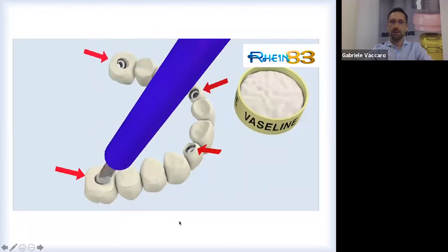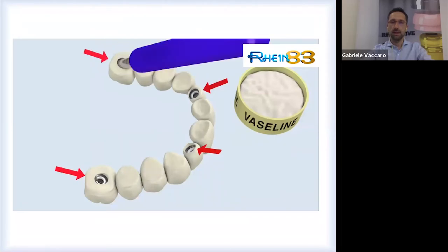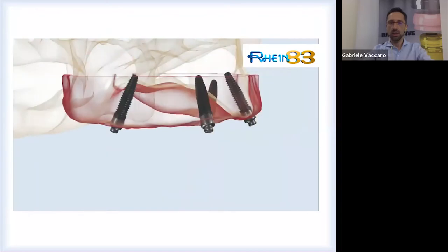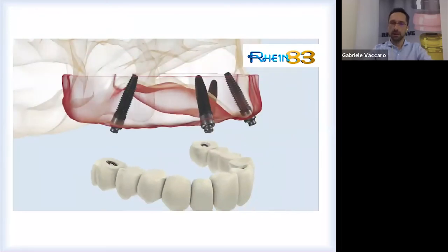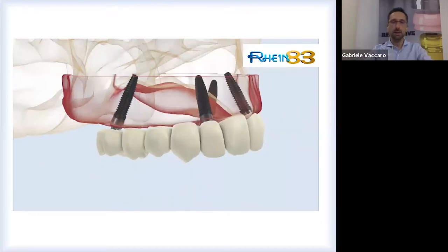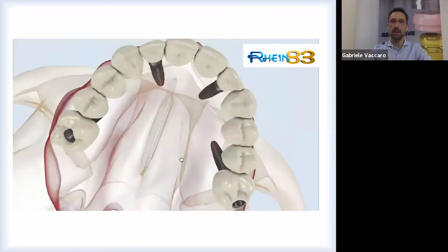And then after that, you just clip following the pattern of insertion. That is the opposite from the lower jaw. You start from the frontal implants this time, and then you clip in the posterior implants.